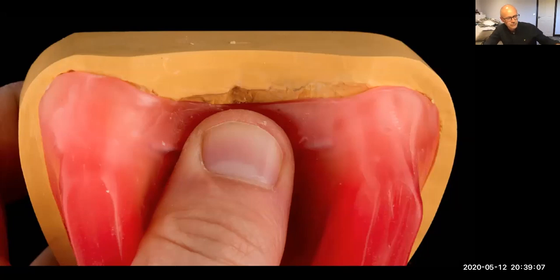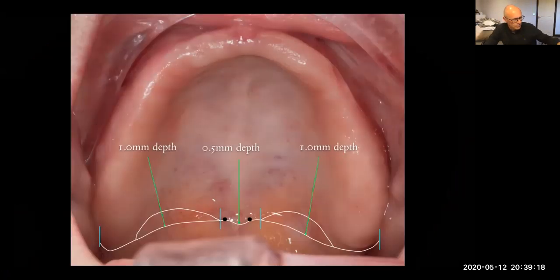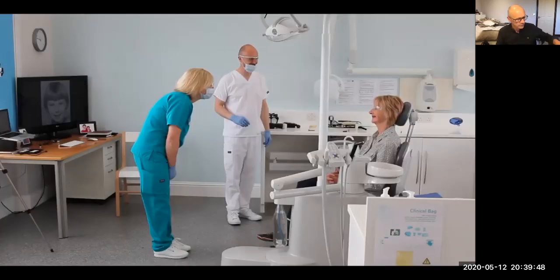And then the back edge of the rim, I warm up in the Bunsen burner and then feed it into that post dam. And it helps to make the rim stay in place because I don't want it moving around. And the other thing that is important is that Rowan makes the lower rim and the upper to the full depth and width of the sulcus, so we are maximizing our retention and support and stability for the rims too.